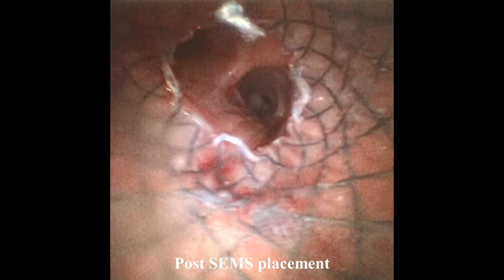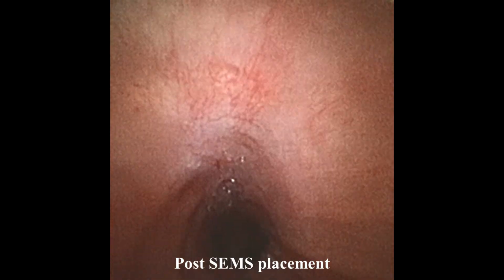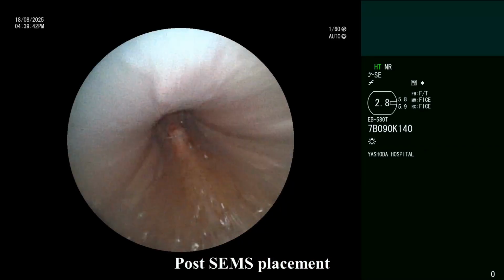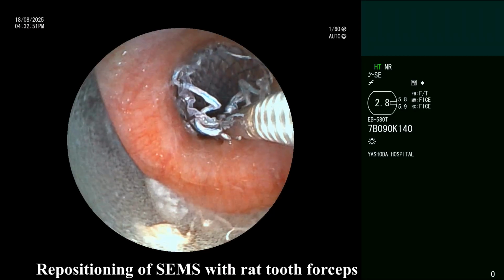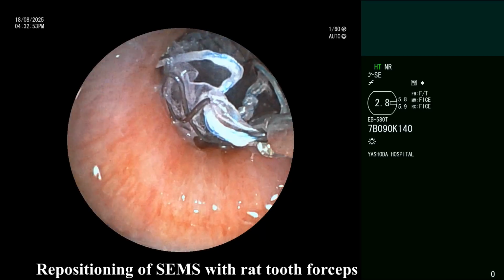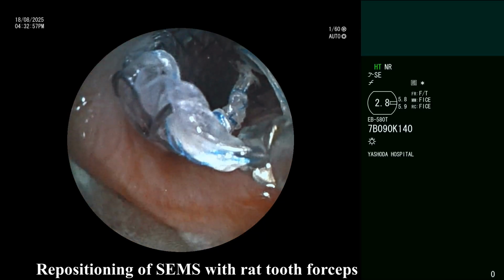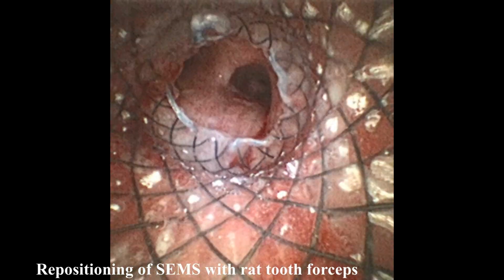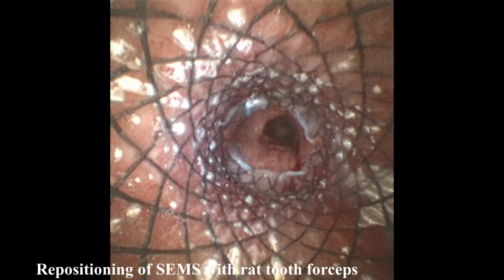And post stent, now I am passing my bronchoscope to visualize the position of the stent with respect to the tracheoesophageal fistula. It looks fairly good, but however I need to pull up the stent a little bit. So what I am doing is I am passing my rat tooth forceps through the working channel of my bronchoscope and holding the thread which is available at the proximal end of the stent to pull up the stent.